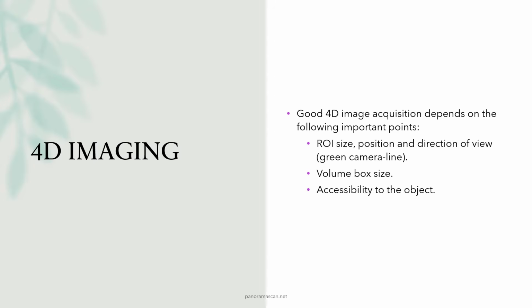Additionally, special attention must be given to potential artifacts, such as speckle noise or shadowing. These can arise from tissue or movement and can degrade the quality of the image. Using the correct filters and ensuring the transducer is properly positioned can minimize these artifacts and help you capture clearer, more accurate images. Patient positioning is critical for achieving optimal results, especially when performing detailed scans like fetal imaging.